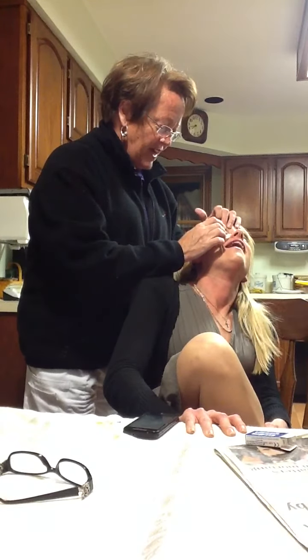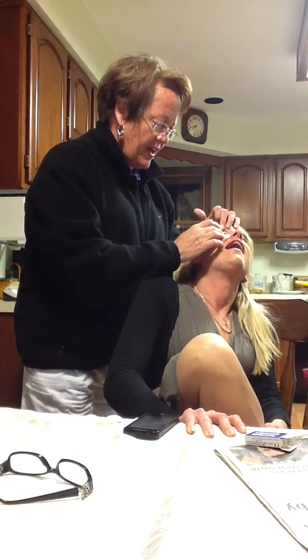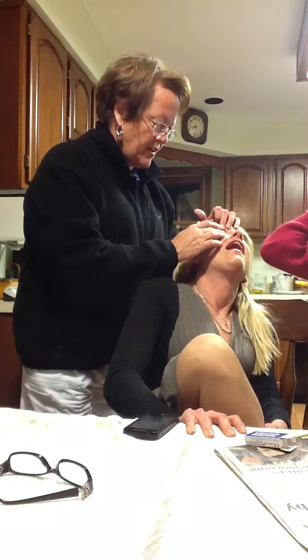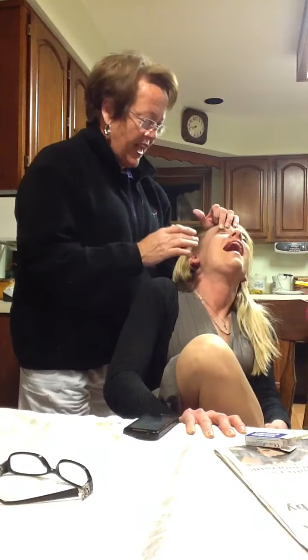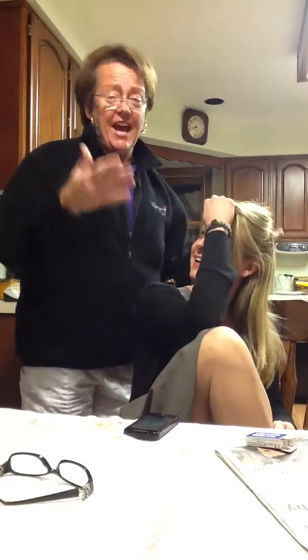All right. Now open your left eye, ma'am. Open your left eye — it releases the muscle in your right eye. Gently look down at your beak and we are successful. And that my friends is how you put contacts in.